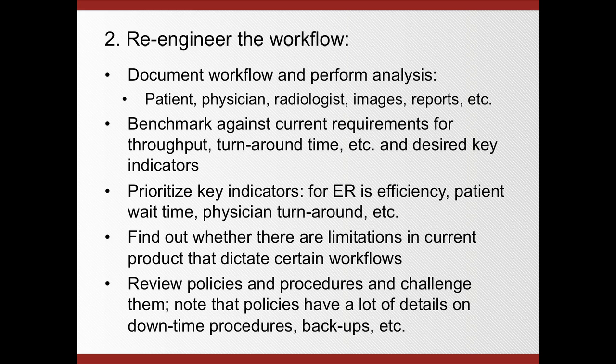The key indicators you pick, you want to prioritize. Again, like I mentioned before, it might be efficiency in the ER, patient wait time, or physician turnaround time. Depending on who it is that you want to please the most, that determines how you want to operate your organization and what your requirements are.